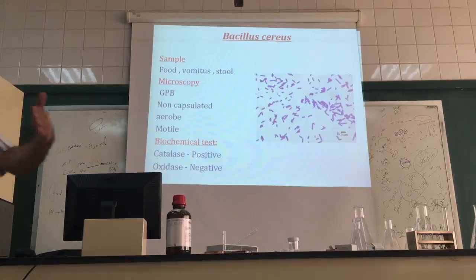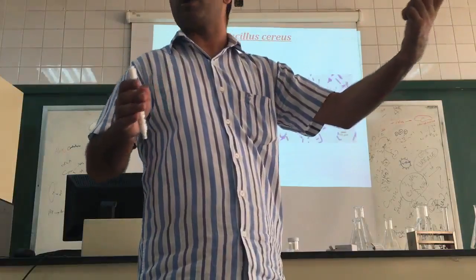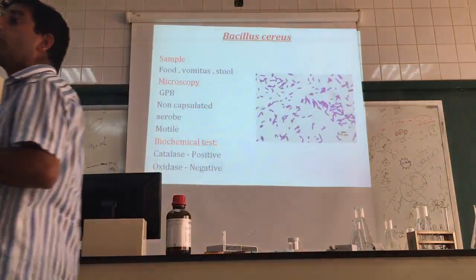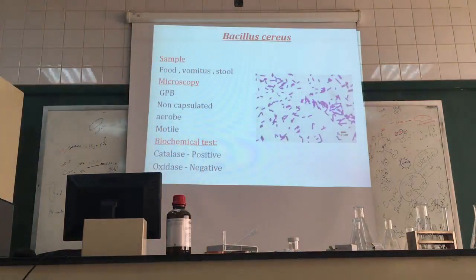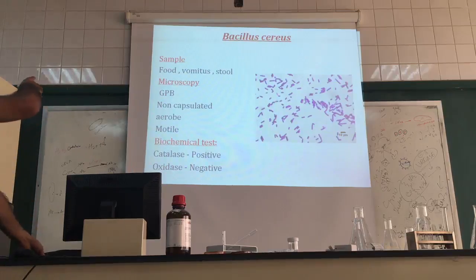And if you keep the same food for one night, for 24 hours, there will be around 1 billion bacteria in one night. So Bacillus cereus is usually present in fried food. If it is present, this means contamination. Usually they keep the food safe. Otherwise, if it were present everywhere, nobody would eat fried rice. So you need a sample of the food.